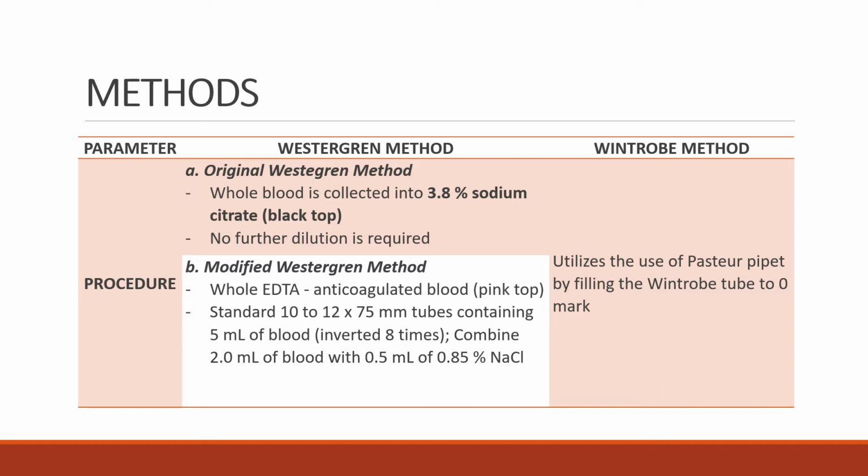For the Wintrobe method, there is only one procedure. You have to utilize your Pasteur pipette to transfer the patient sample into the Wintrobe tube and fill the tube up to the 0 mark.